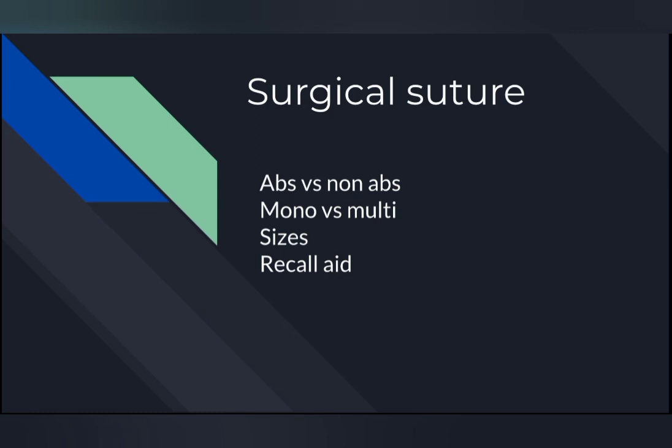First we start with the non-absorbable materials. Just remember this: it's like the things you would see in textile cloth. So you have nylon, you have silk, you have cotton, and you have something called prolene, which is a little bit different, but you understand what it means, right? Non-absorbable is like textile wear.